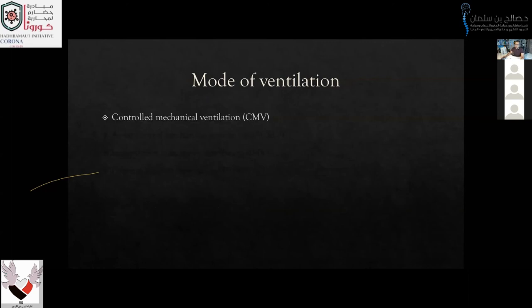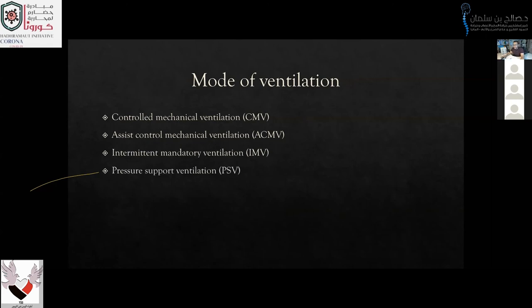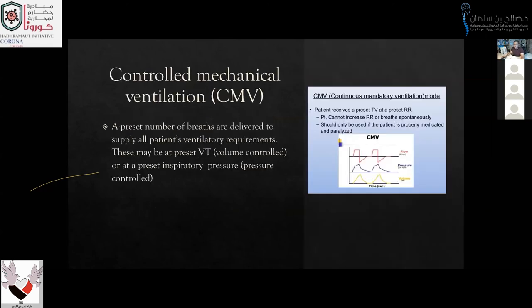Mode of ventilation. Controlled mechanical ventilation, CMV. Assist controlled mechanical ventilation, ACMV. Intermittent mandatory ventilation, IMV. Pressure support ventilation, PSV. In controlled mechanical ventilation, a preset number of breaths are delivered to supply all patient ventilatory requirements. This may be at a preset tidal volume, volume controlled, or at a preset inspiratory pressure, pressure controlled.